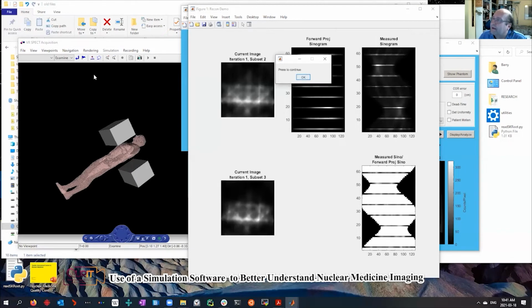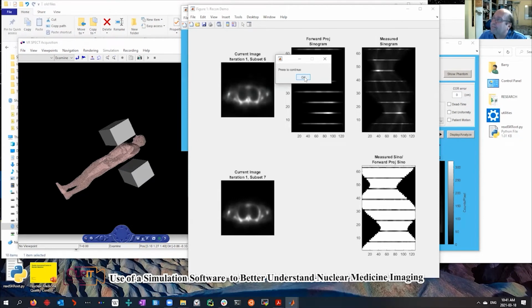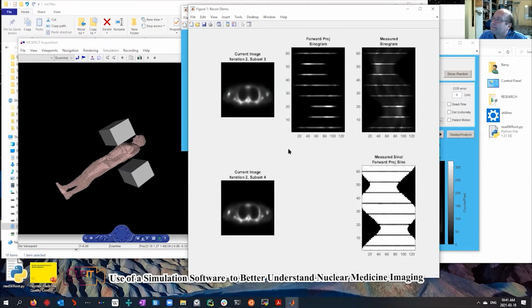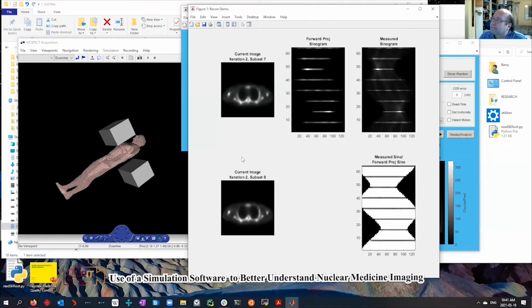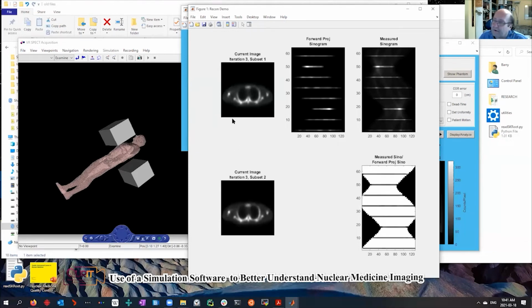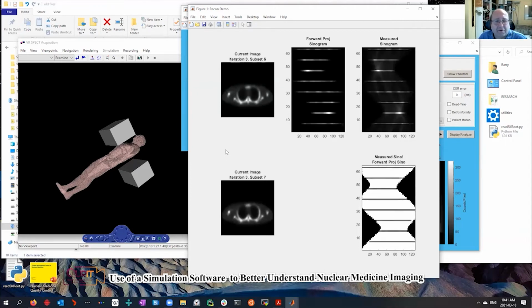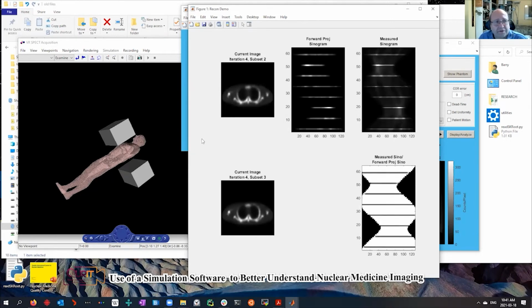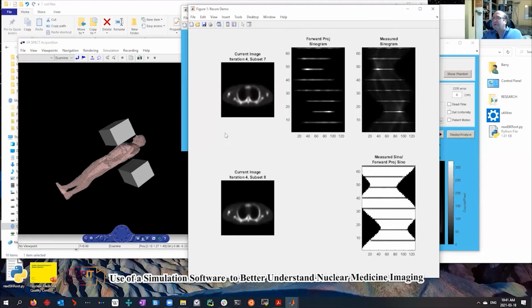And so it updates 8 times per iteration. Right, and you're moving now the angles you're looking at. So at any given time, instead of looking at the entire sinogram space, you're looking at an eighth of it, for example, in this example. And so this makes the image improve 8 times faster. And so that brings it into the realm where it's clinically viable to actually do this. So it uses the same basic methodology as MLEM, but it's 8 times faster so that it's clinically available.